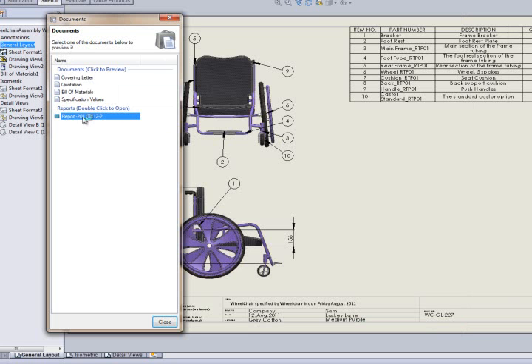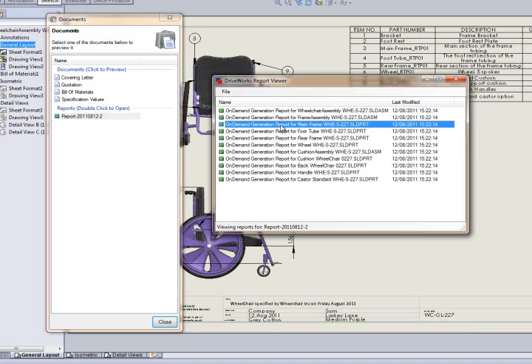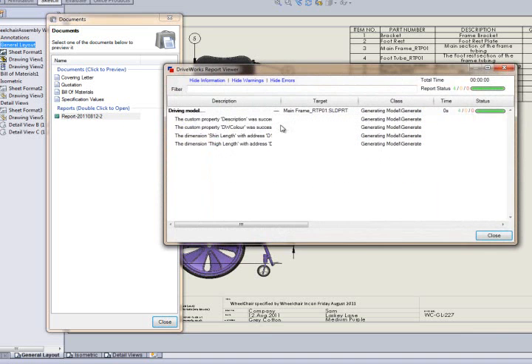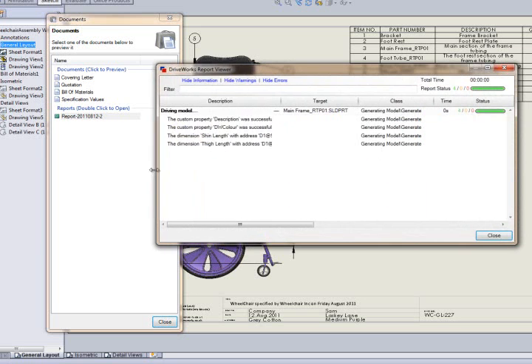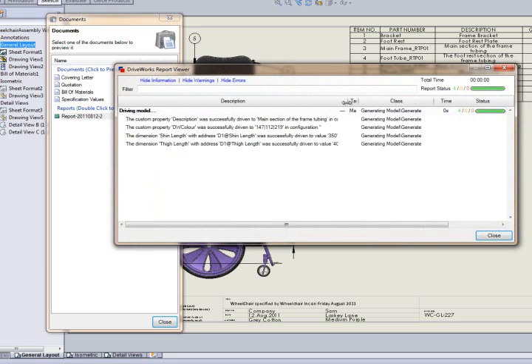DriveWorks Solo also generates a series of reports automatically for every specification run. This provides a detailed audit trail of the steps and actions performed by DriveWorks Solo to generate the outputs. For example, if I open one of these reports, we can see that dimensions and custom properties have been driven.